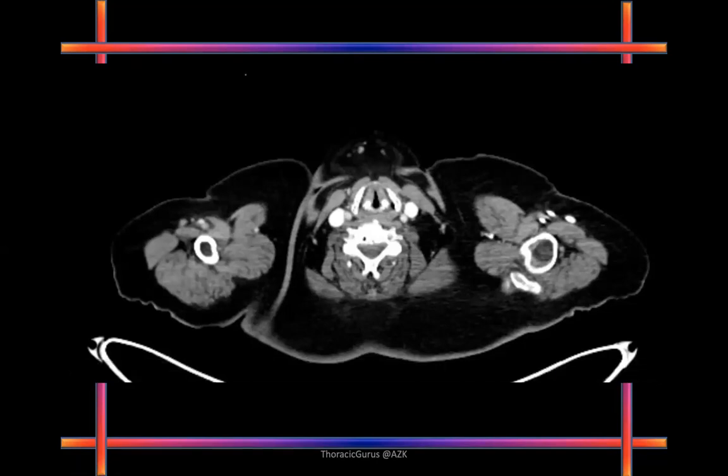Fitoon, first question. What is this? It's CT with IV contrast. Okay. CT scan of the chest. What window are you watching? The mediastinal window. Excellent. So not difficult. Very straightforward question. Very straightforward answer. What phase of the dye do you think was captured? It looks like arterial phase.